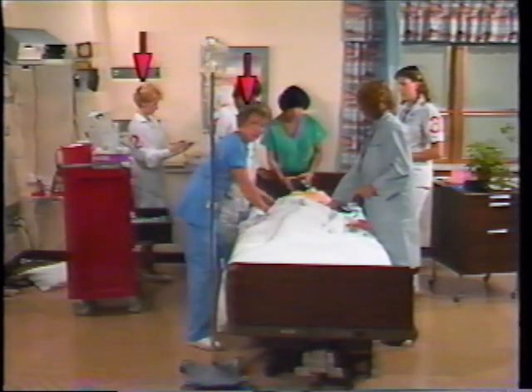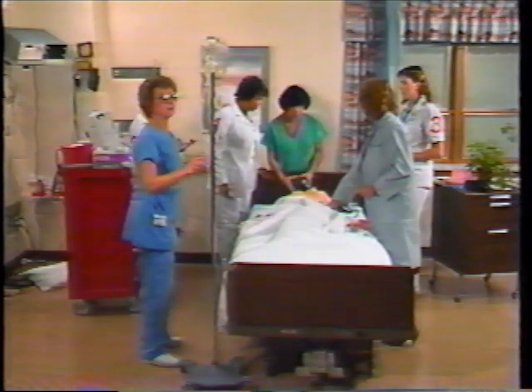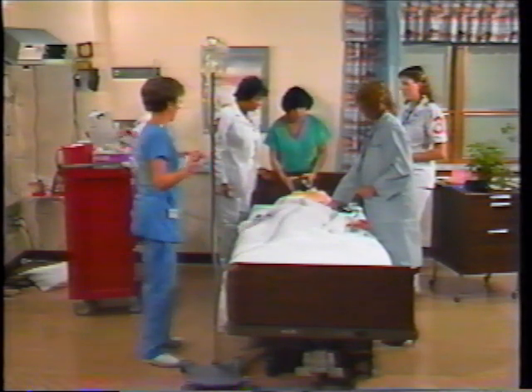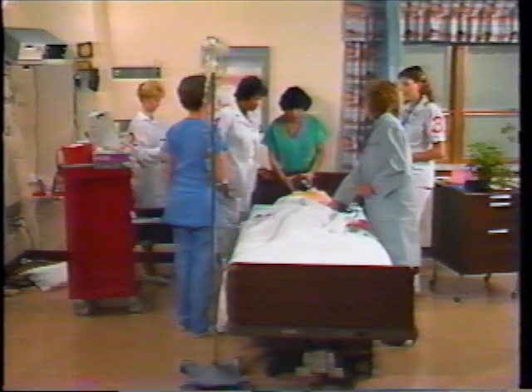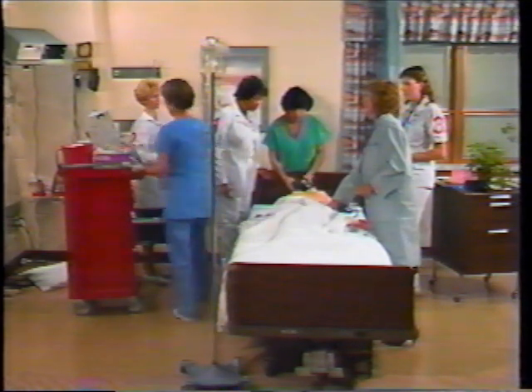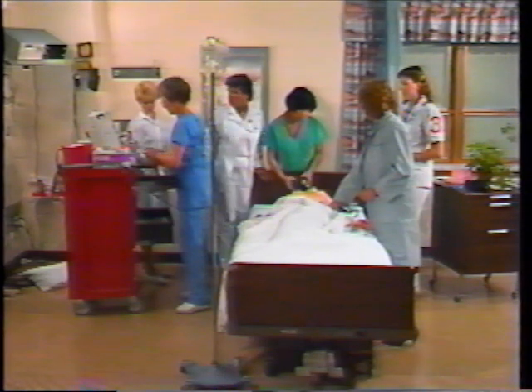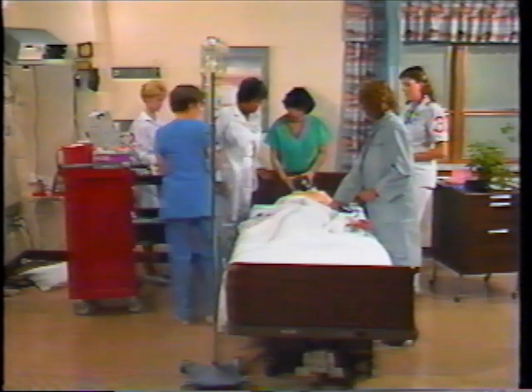I'm going to start it at 5 mics. Okay, 5 mics, I got it. Any response? There's no respiration. Since there are still no spontaneous respirations, anesthesiology continues to monitor the airway. Milligrams of lidocaine. The monitor shows frequent PVCs. The physician orders 50 milligrams of lidocaine IV push to suppress ventricular irritability.